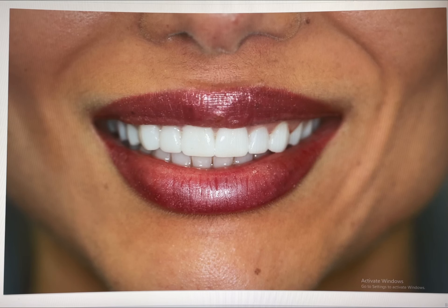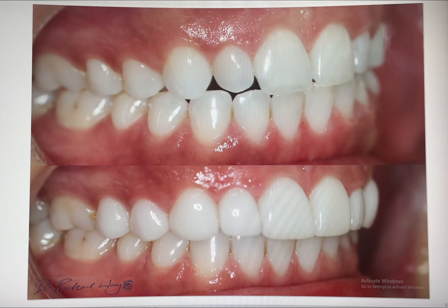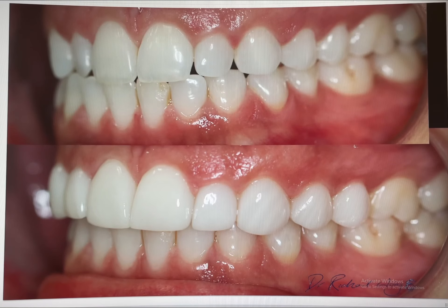So here was the smile design try-in. Our patient was super happy, and so we fabricated the veneers — 10 porcelain glass ceramic veneers in a natural style with a bleach three color and super clean healthy gums. Our patient showing superb oral hygiene.